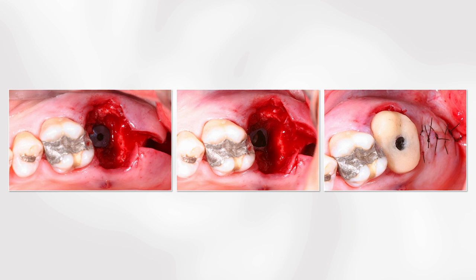And here the main care is the height of this crown. We have to leave this crown shorter than the last tooth to protect it from the antagonist arch during chewing or when the patient is biting over this area. Behind the last tooth, the suture was performed using simple stitches.